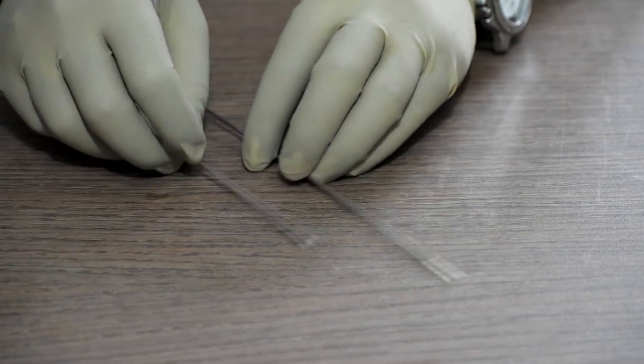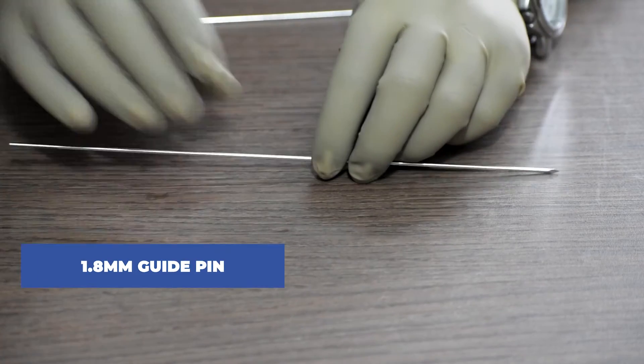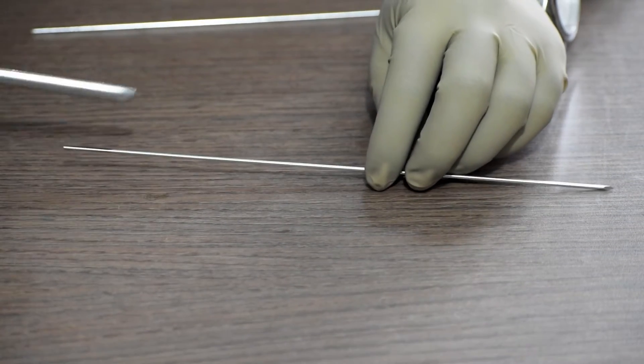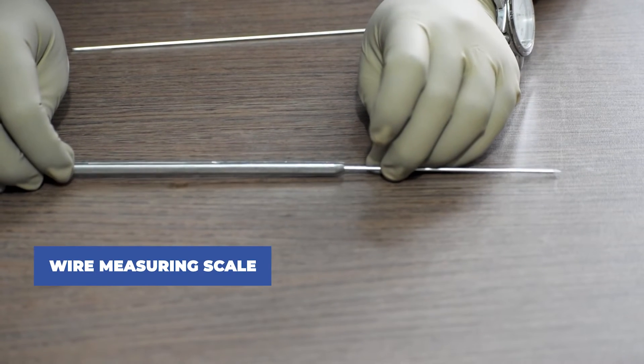First, we will fix a guide pin or guide wire, threaded or plain, depending upon surgeon's preference in the fracture site. Thereafter, we record the length with the help of a wire measuring scale.